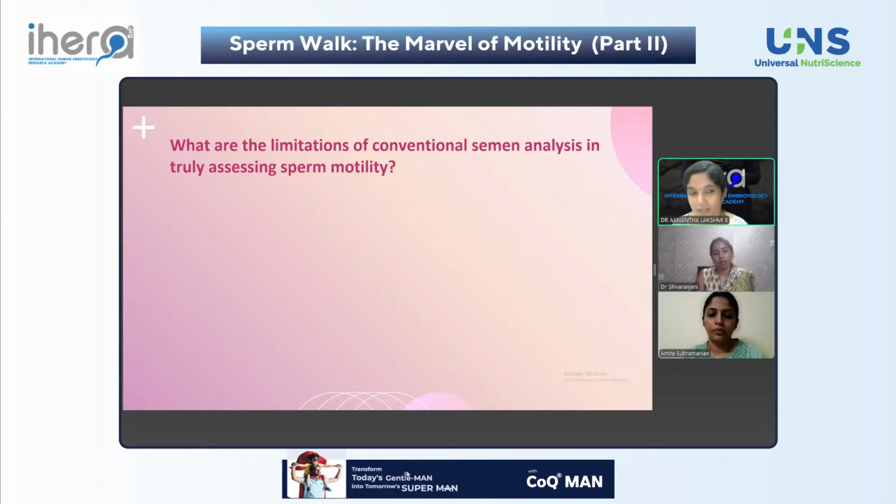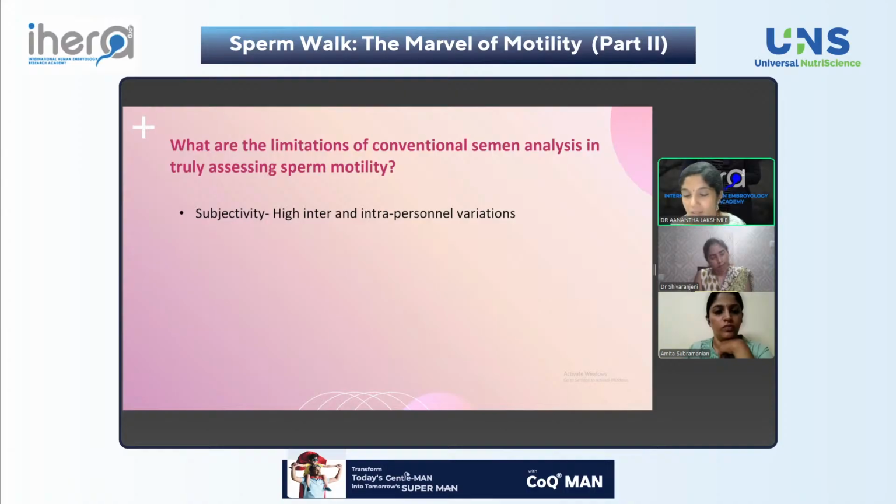Anybody can answer. Subjectivity. Yeah, and interpersonal variations and the abstinence days. I suggest 2 to 3 days of abstinence, while WHO recommends 2 to 7. So that also affects the motility. This is about conventional analysis versus CASA.